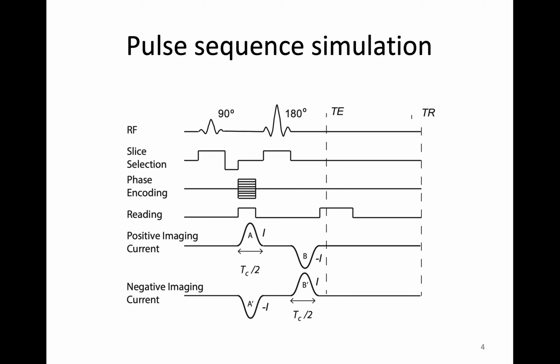The amount of current-related phase signal encoded in an image depends on how much current flows during the sequence echo time. In the spin echo MREIT sequence shown here, we inject a positive current after the 90-degree RF pulse and the opposite current after refocusing in order to preserve the signal. In many cases, we repeat an image using the same sequence but with a negative going current pulse just after the 90-degree. These two images may then be subtracted, which produces a composite image with twice the amplitude and without any systematic background phase.